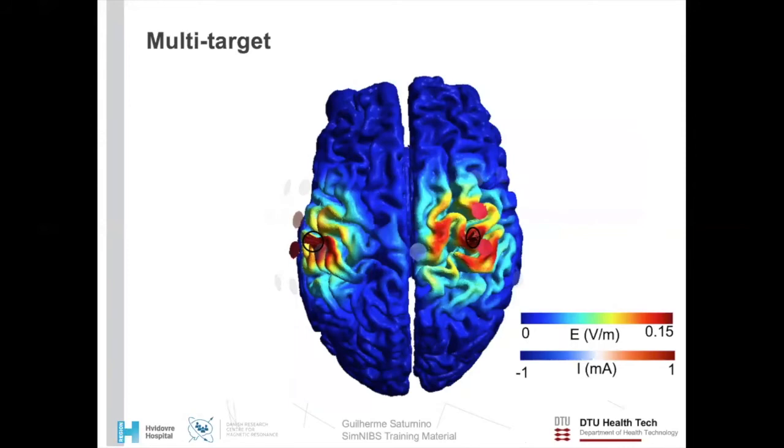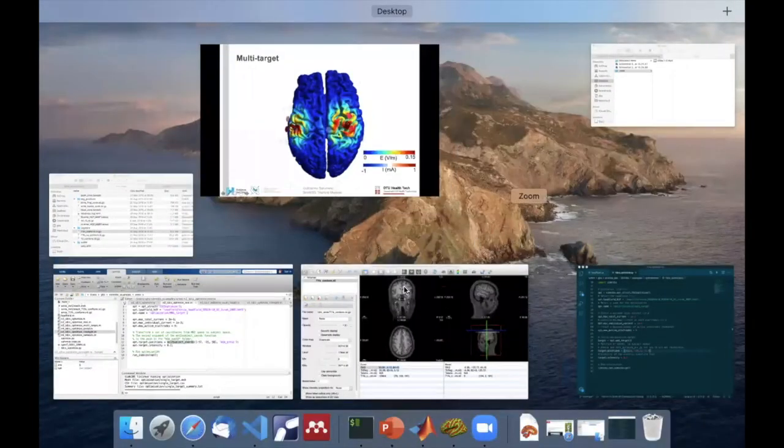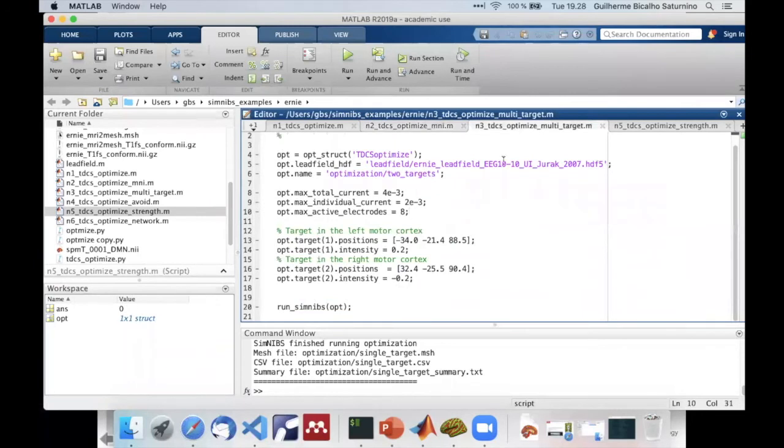The formulation that SimNIBS uses for optimization problems is very flexible. It allows for the user to define multiple targets, which would be considered independently to a larger extent. In this example, we define two targets, one in each hemisphere. As you can see, we have basically one focus here and another focus there. And here we have the code to run this kind of optimization. It's also pretty straightforward. We just set one target and set the other target just as we set the previous one.